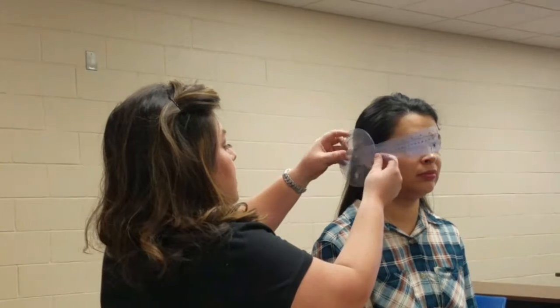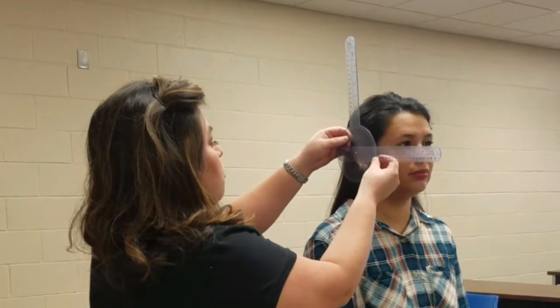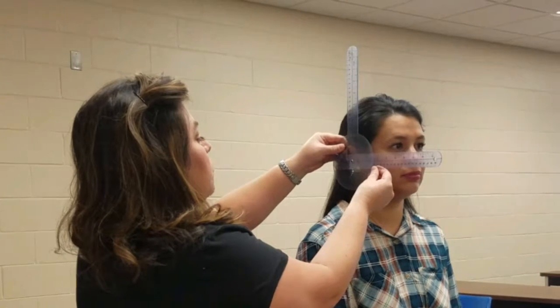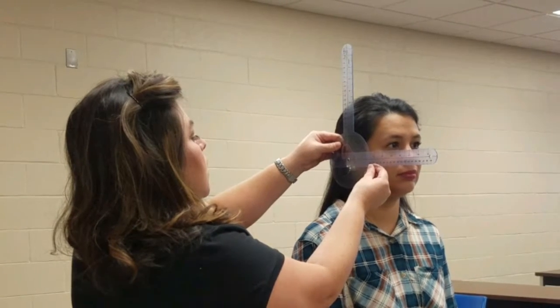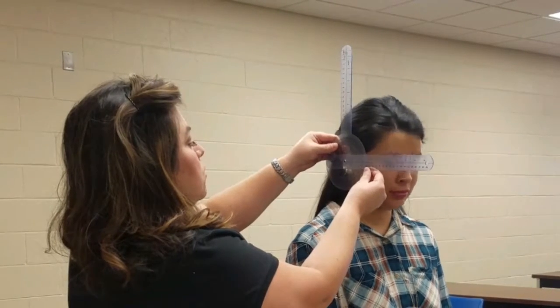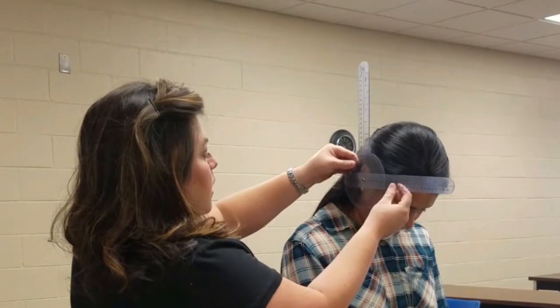The fulcrum of the goniometer is going to go over the external auditory meatus, and the stationary arm is going to go perpendicular to the floor. We're going to align our movable arm with the base of the nares. I'm going to have the patient move into cervical flexion. Can you put your chin down, please, as far as you can go? Let me realign here.